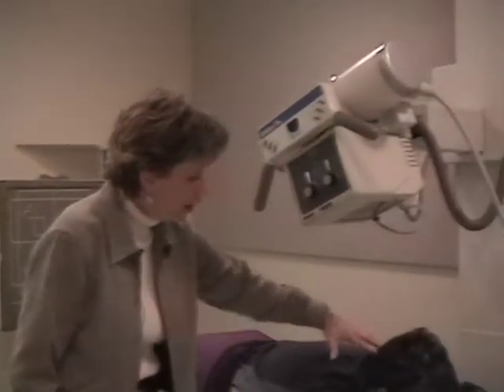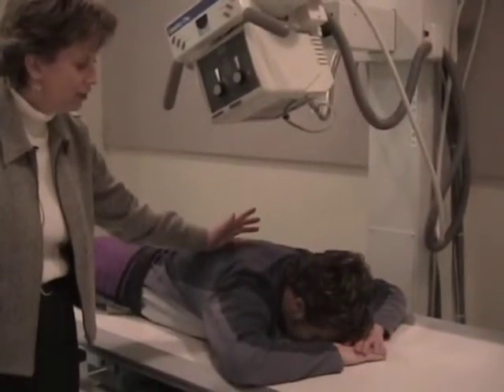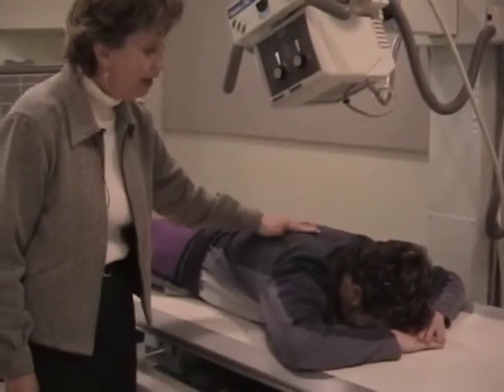I'm going to do a demonstration today for a PA axial of the skull, also referred to as a Haas. In the event you need to do a skull series or a mandible series, someplace where you normally do an AP axial, and the patient is kyphotic and they cannot tuck the chin in order to get the orbital meatal line perpendicular, for some extreme reason that they cannot tuck the chin, you can do a PA axial. If you look at the patient, let's just pretend they're kyphotic. They would not be able to lay on their back and tuck that chin, but whether they're kyphotic or not, they can lie on their tummy.